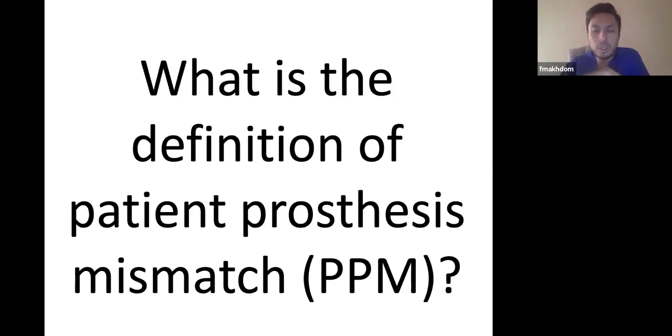So if there is calcification in the LVOT or a hypertrophied septum, it might be challenging to position the valve and have a good result. All of these pitfalls have to be considered.